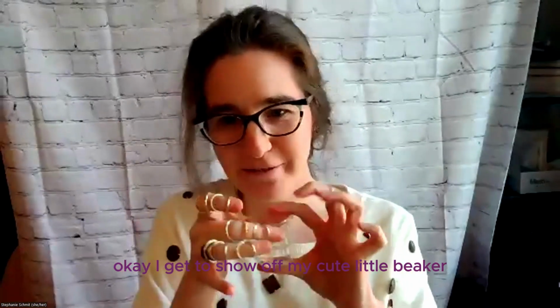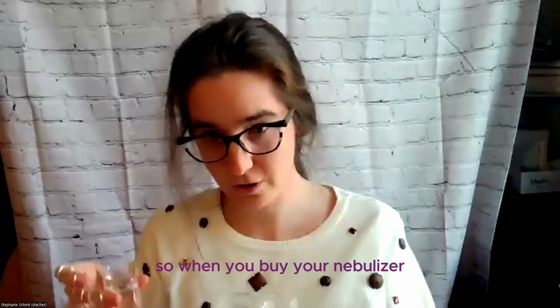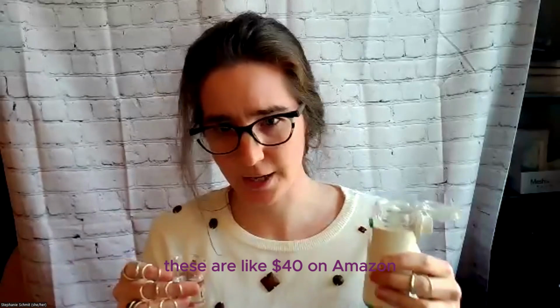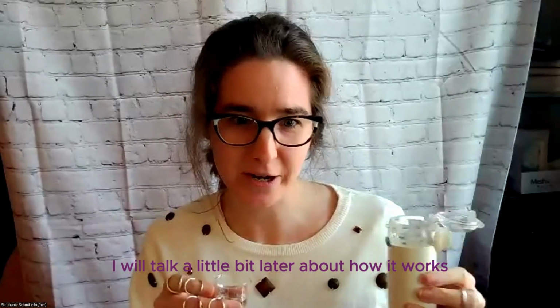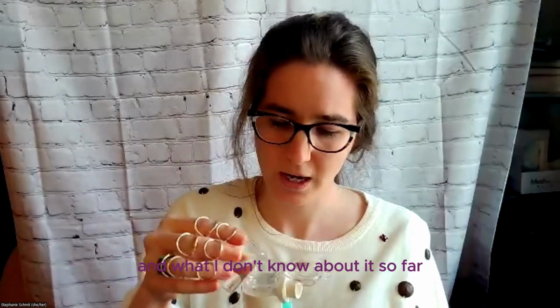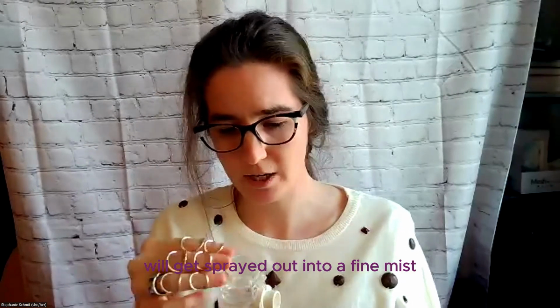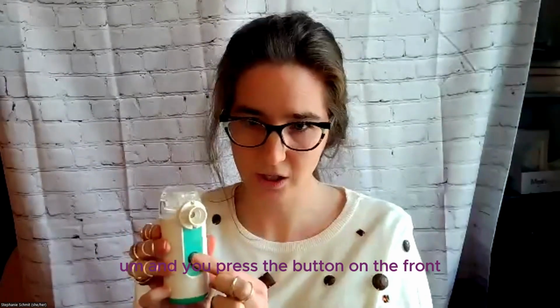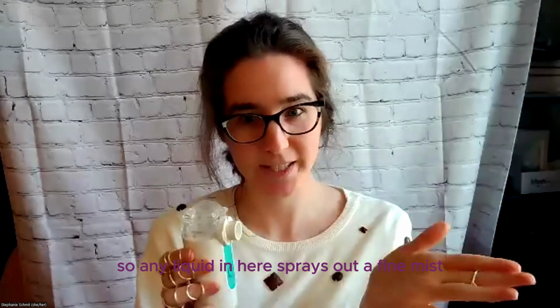I get to show off my cute little beaker. This just says water in it. So when you buy your nebulizer, these are like $40 on Amazon. I'm sure there's lots of different kinds. I will talk a little bit later about how it works and what I do know and what I don't know about it so far. But any liquid that goes in here will get sprayed out into a fine mist. And you press the button on the front, and here comes out the mist.